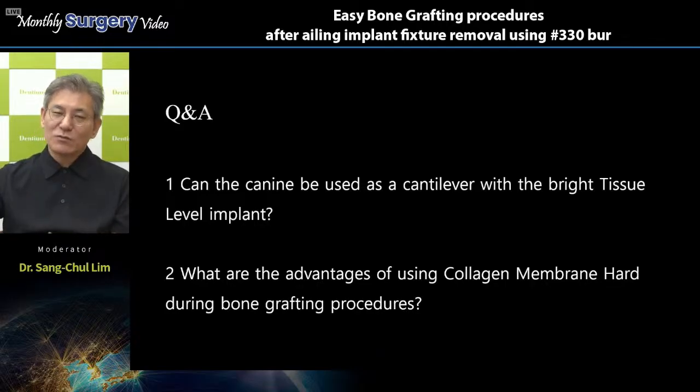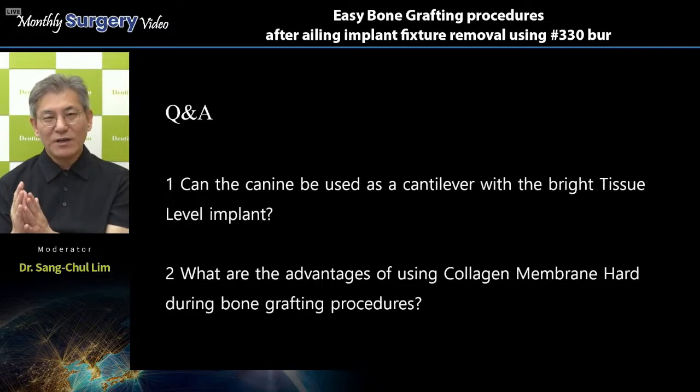Let's see, after removing the ailing implant fixtures, and then the bone grafting or the installation, we make the osteotomy. Let's think about this osteotomy. Maybe during just 2 drills, even with the two drilling, the distal bone plate might be squeezed distally, because this area is void, right?